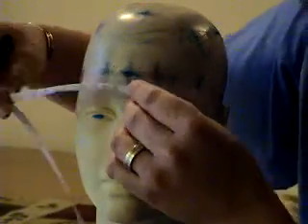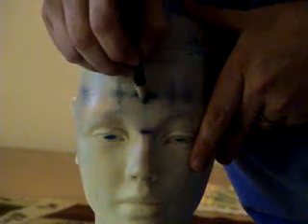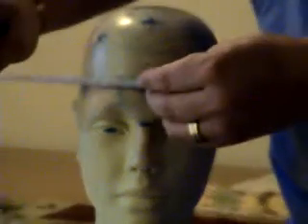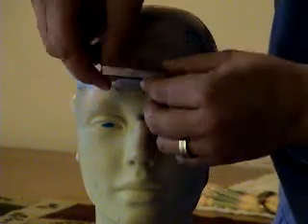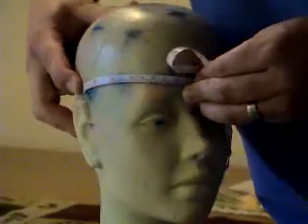After you've made those marks, the next step is to do the circumference. So that you have a nice line to go by, you can look down the patient's nose and draw a line right across there, which again is FPZ. That way it gives you a marking point. Take your tape, bring it all the way around, making sure to pass through the OZ, which was in the back, and your lines to the side right here, just above the ears.